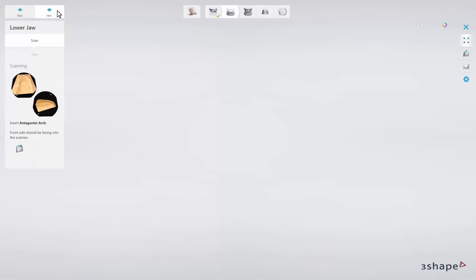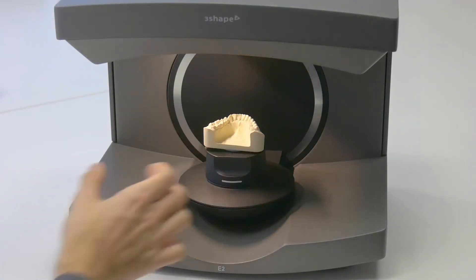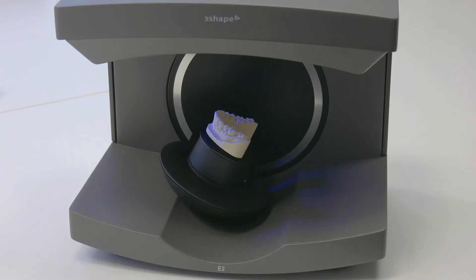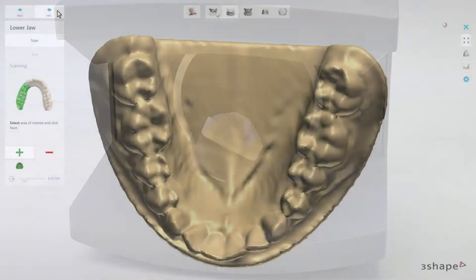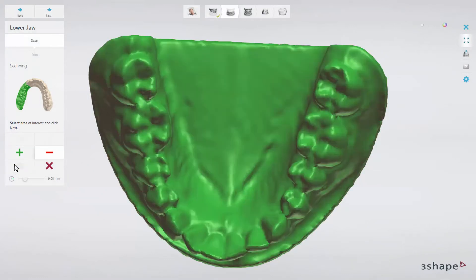Now you are going to be asked to insert the antagonist arch. Place the antagonist model on a plate using the BluTac and insert it into the scanner, then wait until the scanner starts scanning if the Auto Start option is enabled. Based on the selection of the preparation arch, the software will pre-select the area on the antagonist, or you can click the Select All button and then Next to continue.